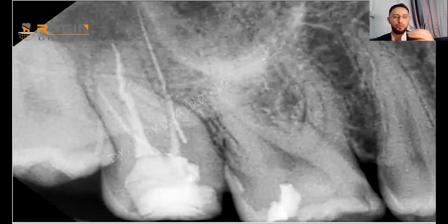Here is a clinical case that came to my clinic. The patient had a previous root canal treatment, and as you can see, the previous treatment had a broken file in the mesial root. Unfortunately, the dentist tried to bypass this file, caused a perforation, and did not notice it had occurred.